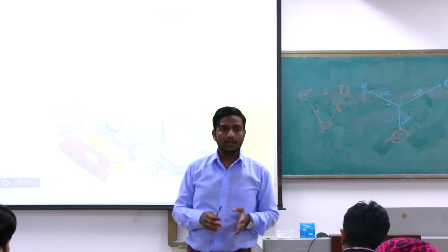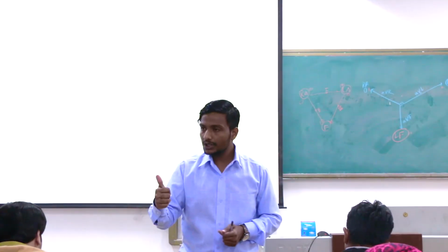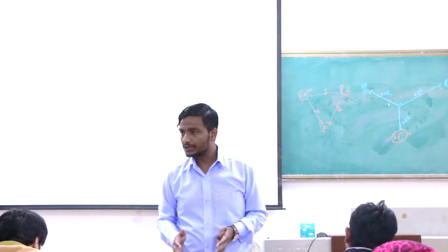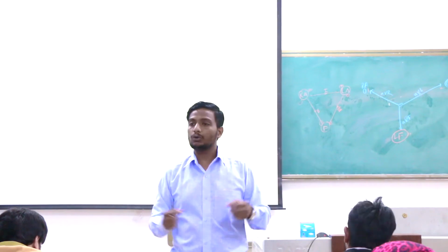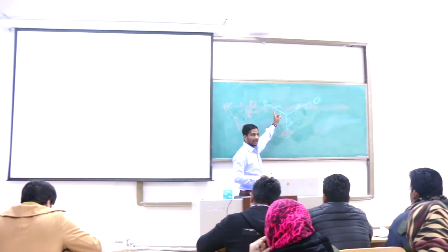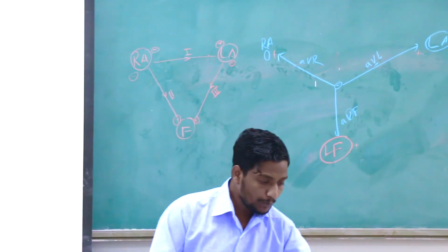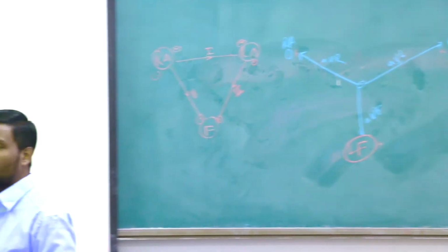Limb leads. So now what have we learned? We have got 4 limb electrodes. Out of 4, one is neutral. Which one is neutral? Right. And out of these 4 electrodes, one is neutral, and 3 are the ones that produce the leads. These 3 will work alone as well as in a group. When they work alone, they produce the unipolar leads. We call them AVR, AVL, AVF, and when they work in a group, bipolar, we call them lead 1, 2, and 3.